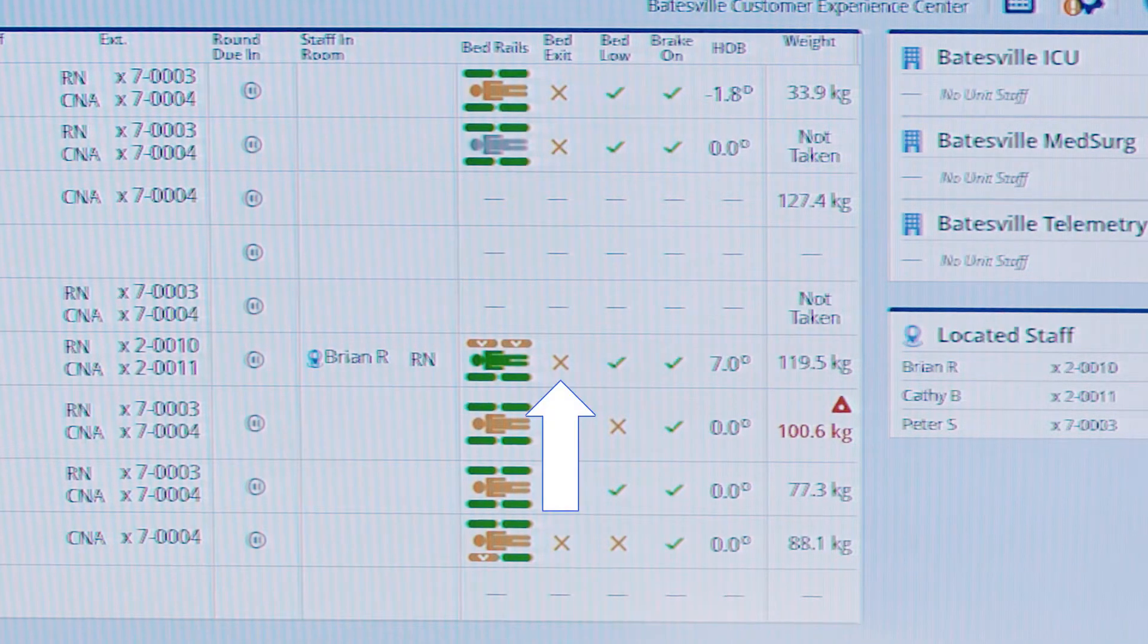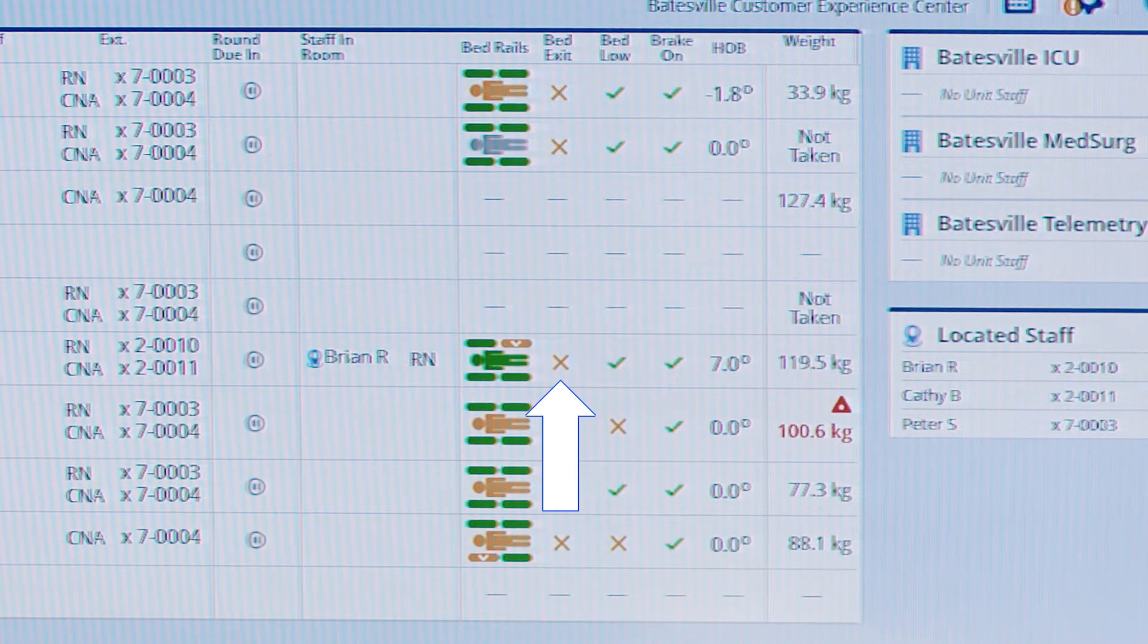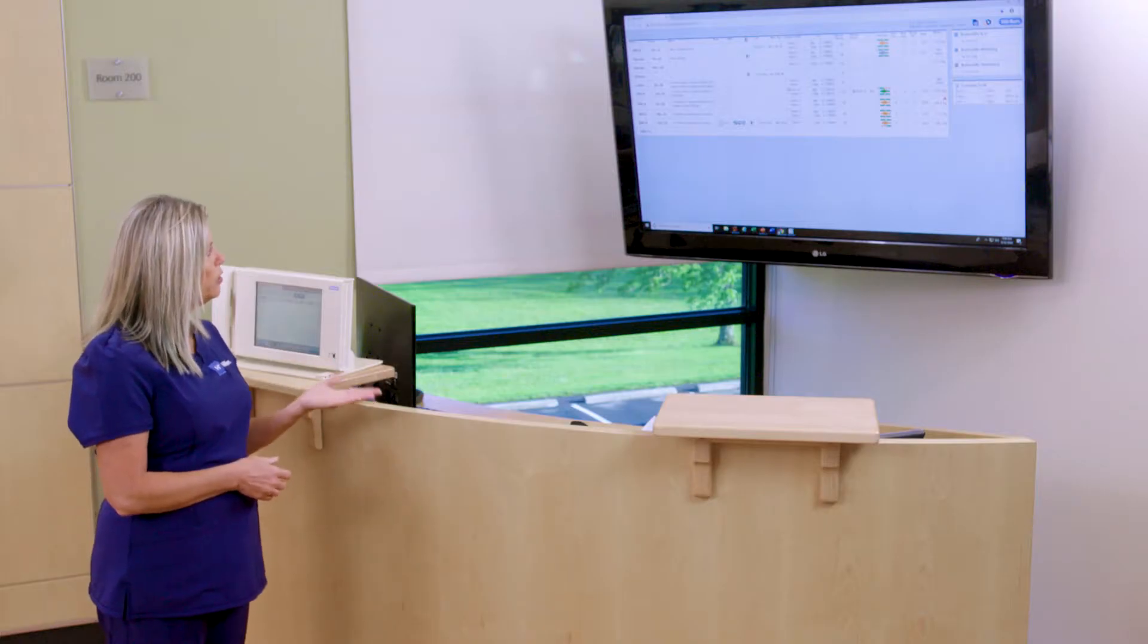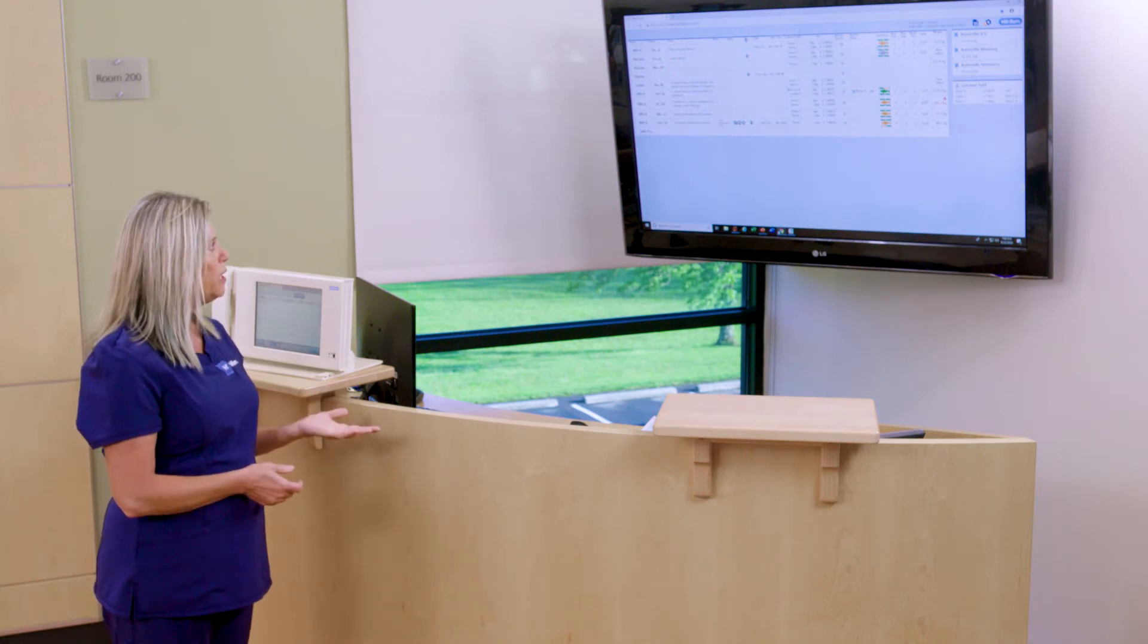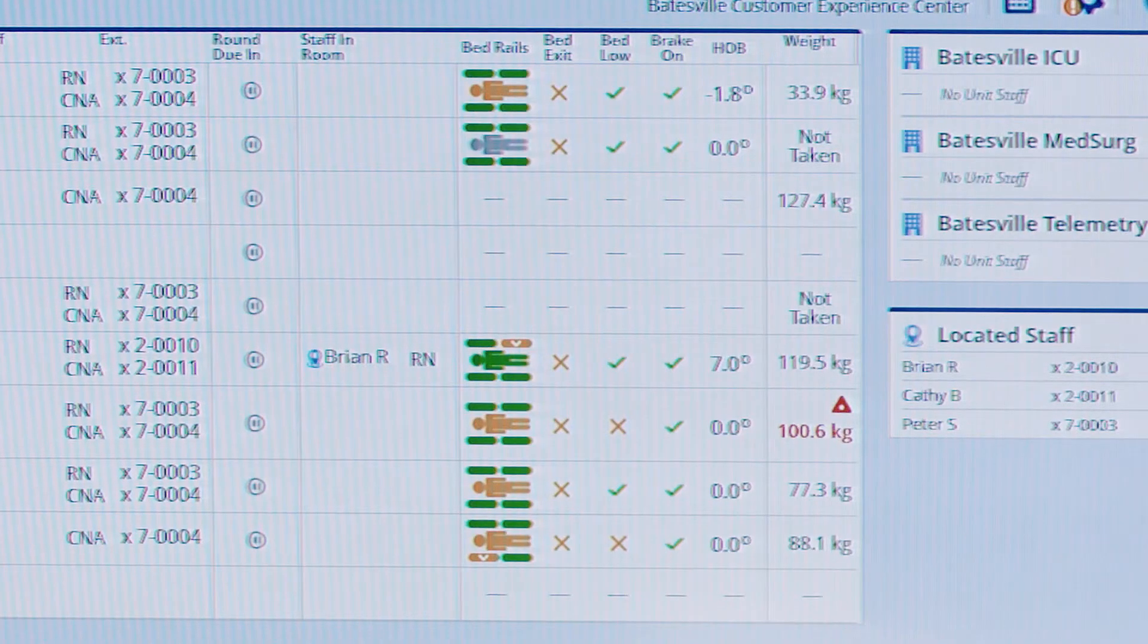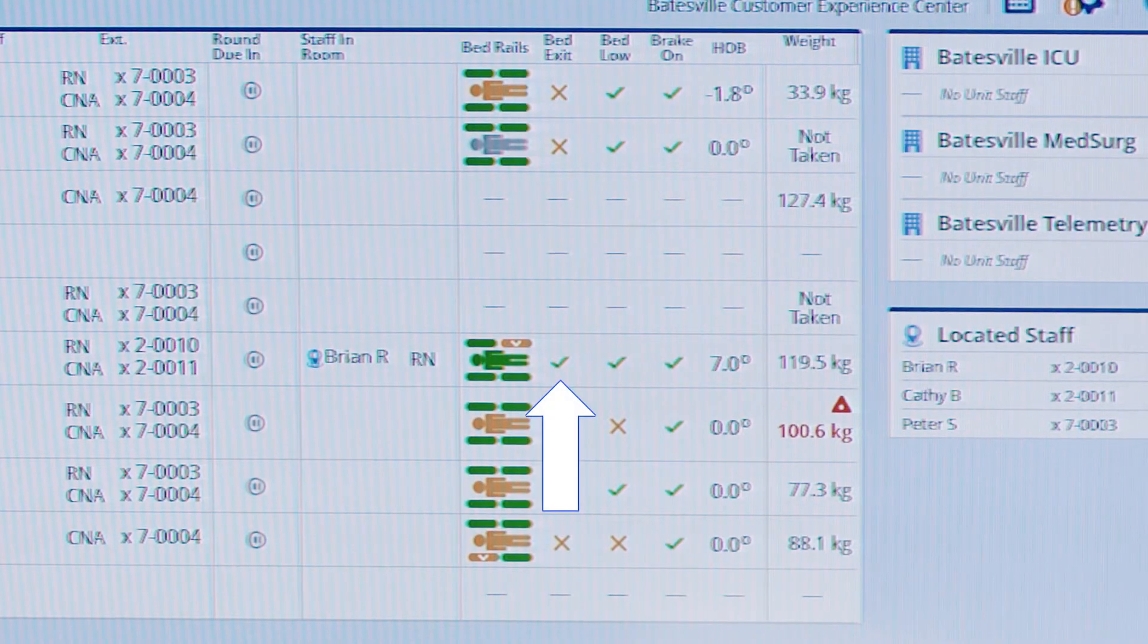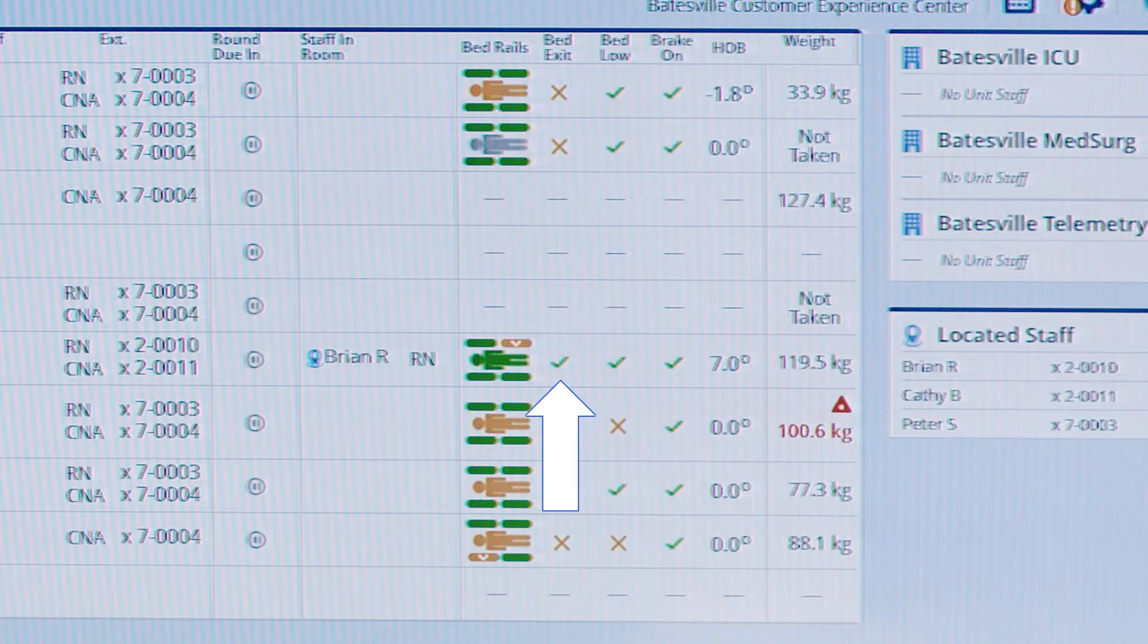We can also see an indicator on whether or not the patient's bed exit is set. Currently the bed exit is not set, but when a care team member enters the room and places the patient with the bed exit on, we will see a change in the indicator. We now can see that the patient's bed exit has been set.